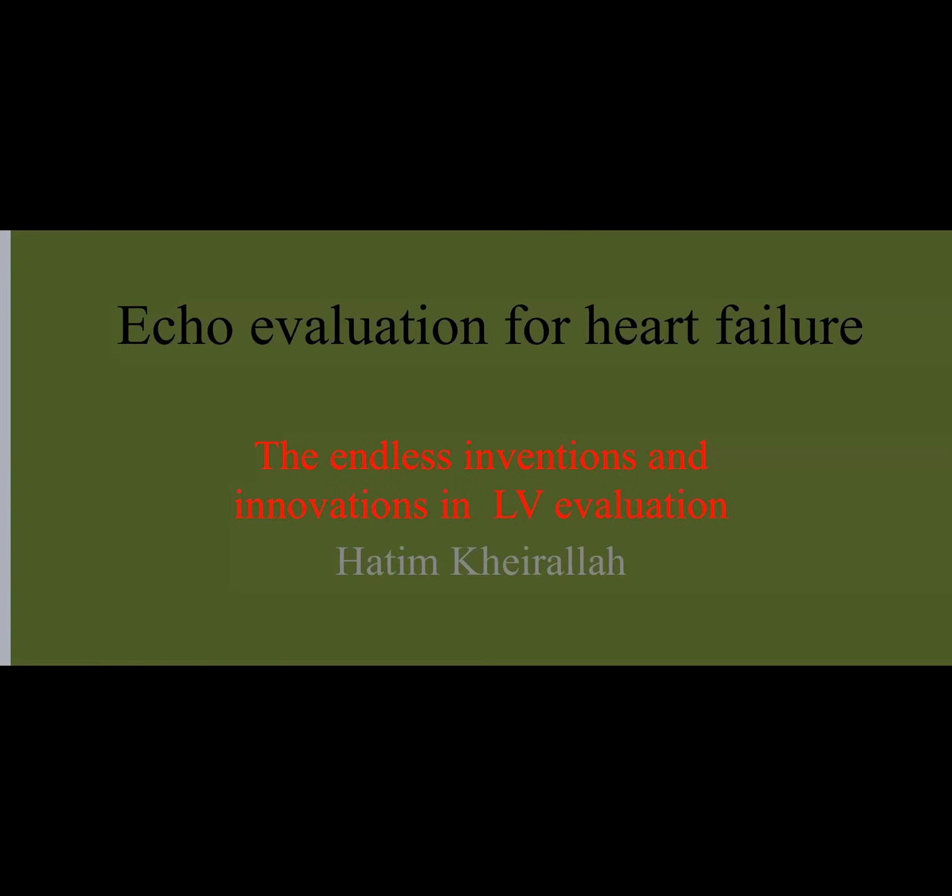The topic may be long or short, but I'm just going to take you through the account of echo evaluation for LV systolic function, and all the technologies and measures used by echo for LV systolic function assessment, the ones you are doing in Sudan and the ones you are not doing. I'm going to explain the standardized ways and measurement of LV systolic function assessment.